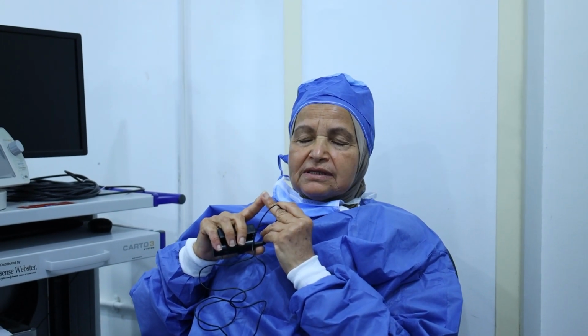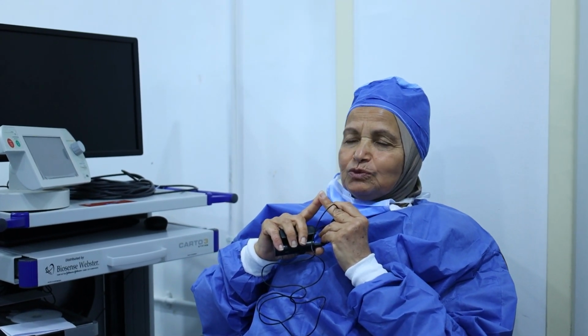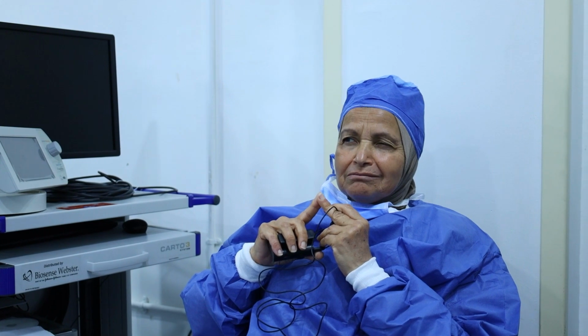This is a case of typical atrial flutter, counterclockwise atrial flutter, which was recurrent in a normal heart. So we decided to go for ablation. We used two 10-decapolar catheters, one in the CS and another one in the right atrium instead of the halo. I stopped using the halo because it's a big one, it's maybe injurious.